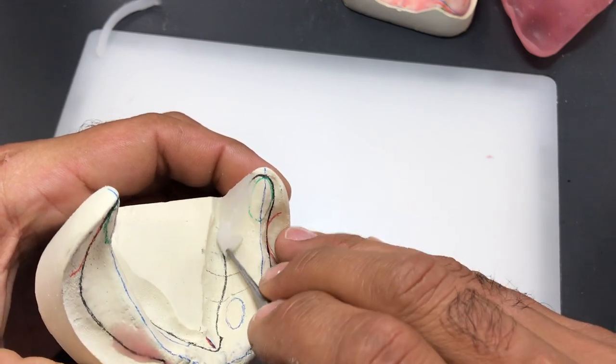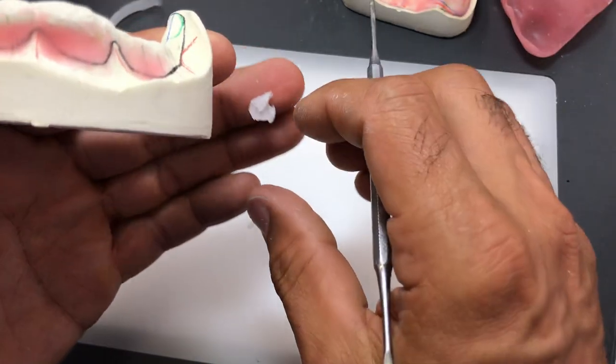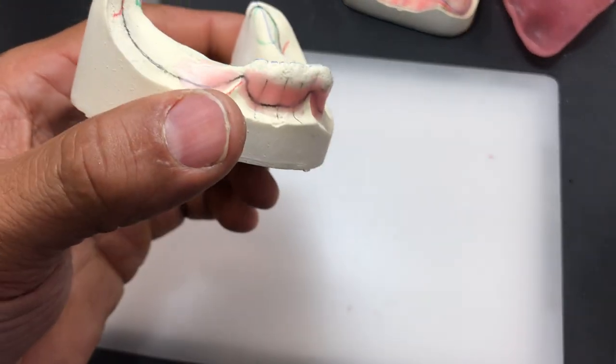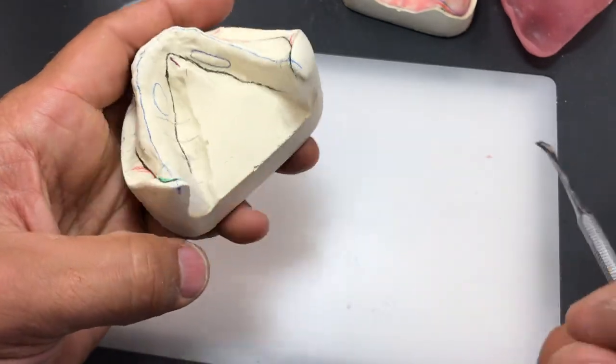Obviously, I've obscured a lot of the outline that I had before, and that area now becomes a bit of a guesstimation where we're going to cut it back. But I think as we work through it, you'll realize it's not that difficult.